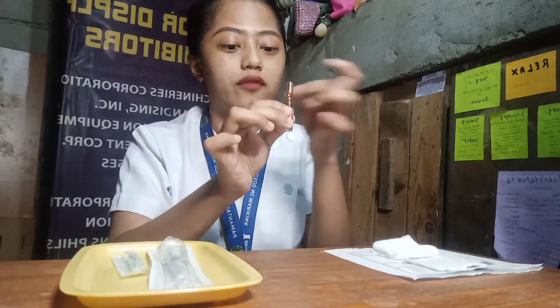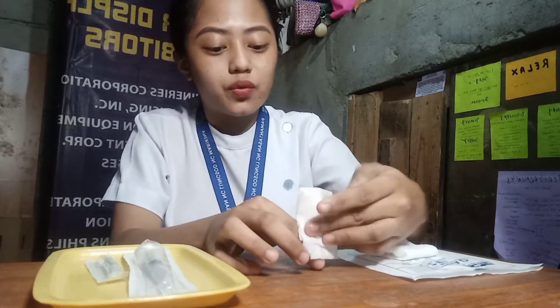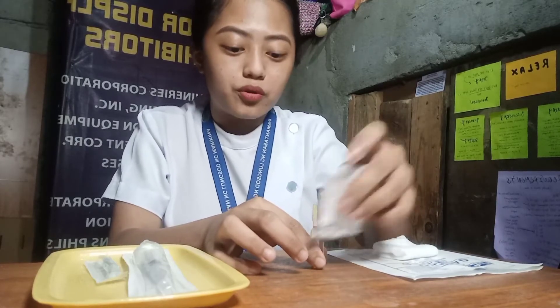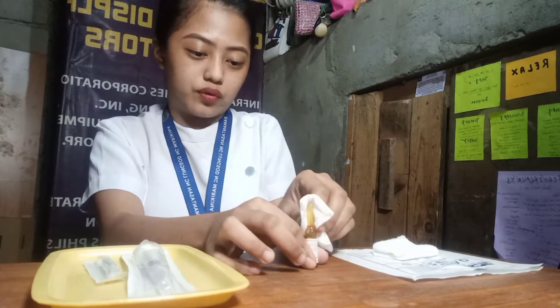We will now proceed on the breaking of the ampule. First, we need to flick the top using our fingernails to ensure that there are no air bubbles or medication left on the top. After that, we need to get our alcohol pad and clean around the neck of the ampule before we break it.